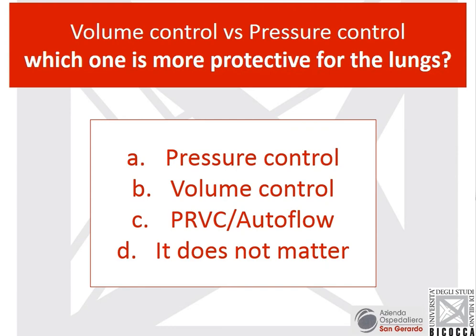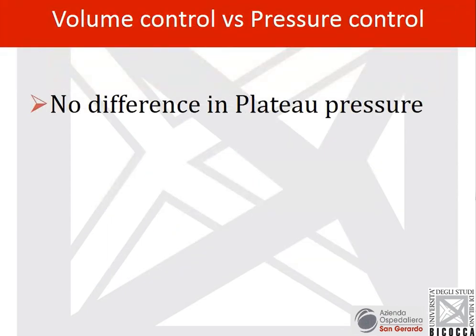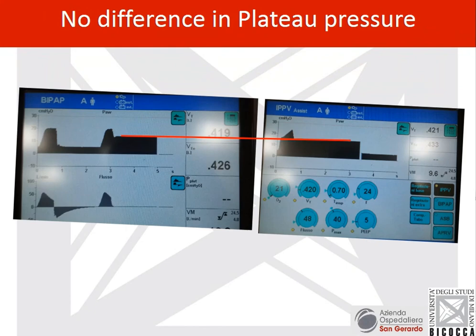Who thinks pressure control is better for the lungs? Who thinks volume control is better for the lungs? C? D? It doesn't matter? Okay, great. Why it doesn't matter? Because it's really an irrelevant question. For the same tidal volume, the driving pressure will be exactly the same, and the plateau pressure will be exactly the same no matter whether you are in volume control or in pressure control.